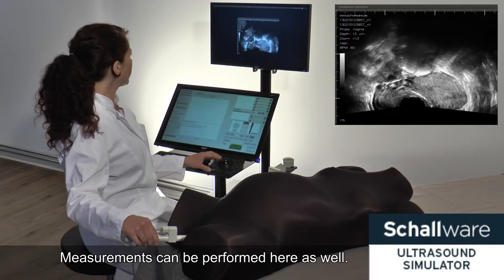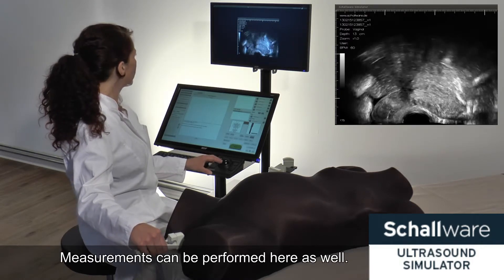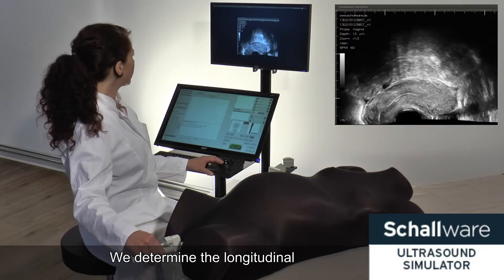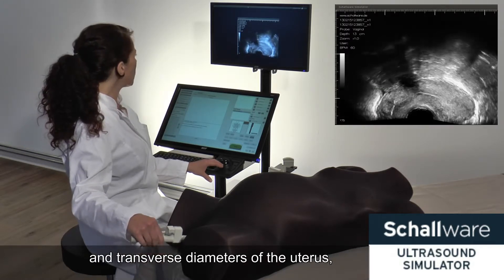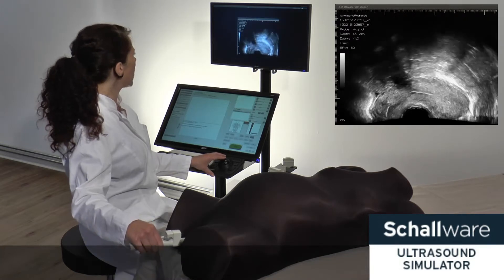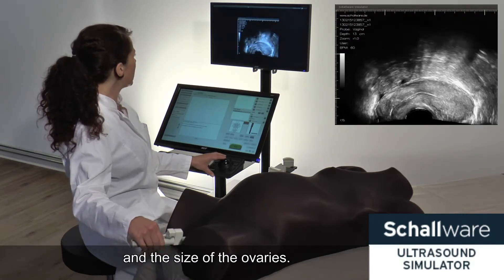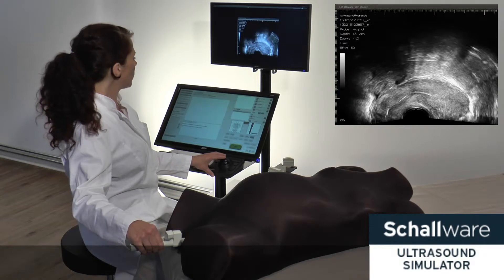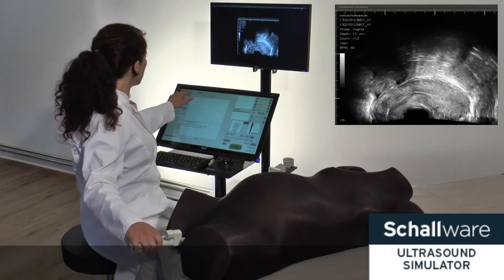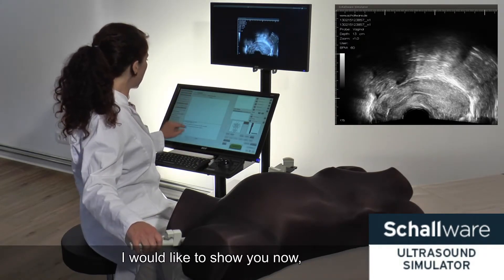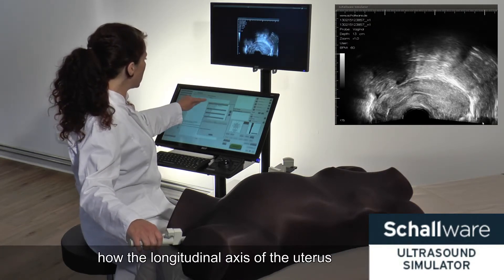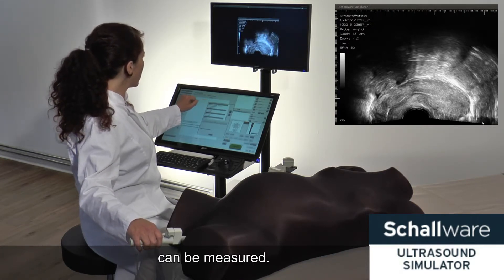Measurements can be performed here as well. We determine the longitudinal and transverse diameters of the uterus, the thickness of the endometrium, and the size of the ovaries. I would like to show you now how the longitudinal axis of the uterus can be measured.